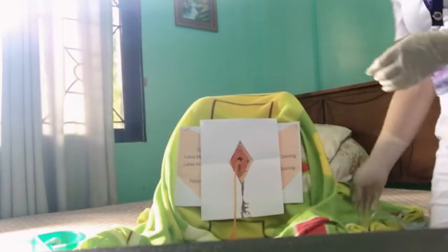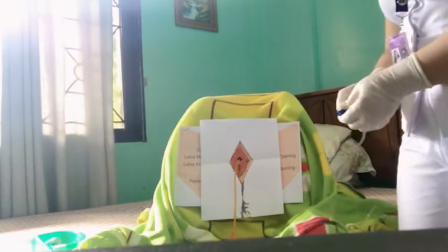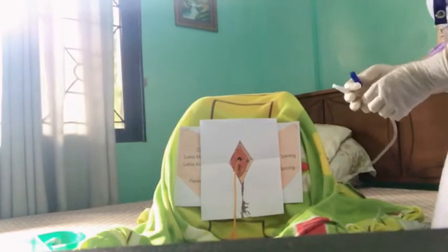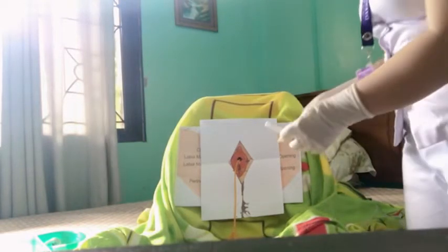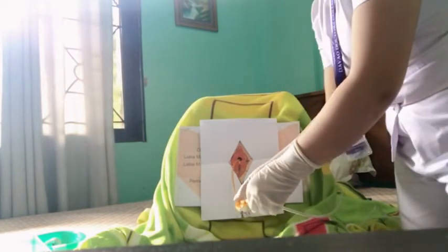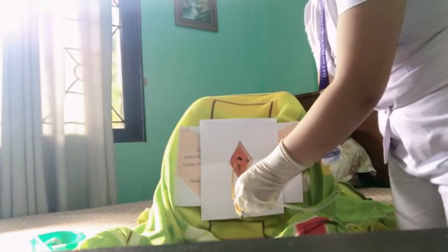Okay. So let's connect it to the catheter of the urine bag. Uncap the urine bag so that the urine will not leak from the bag and to maintain its sterility, then insert the connector to the urine bag.